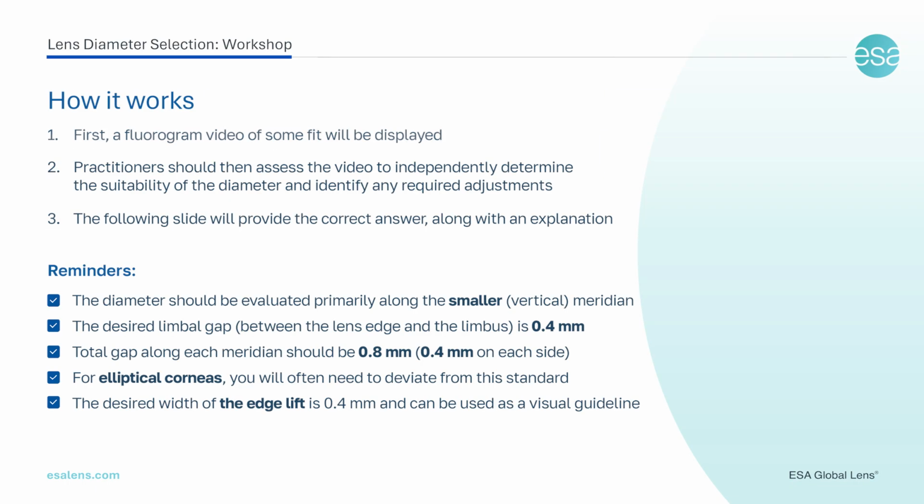You will now be presented with some videos. Your task will be to assess whether the lens diameter corresponds to the corneal diameter and, if not, decide exactly how it should be adjusted to optimize the fit. The correct answer will then be provided, along with a clinical explanation.